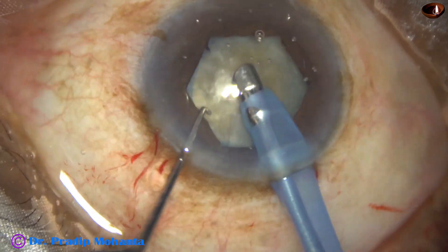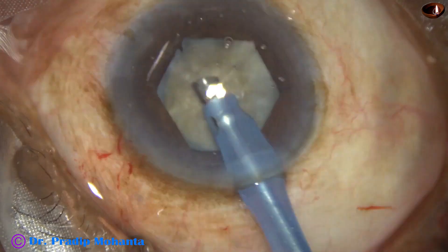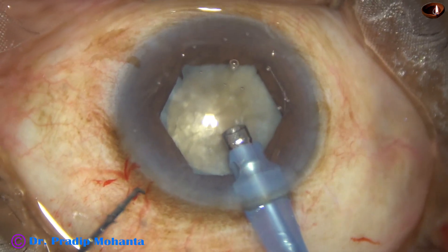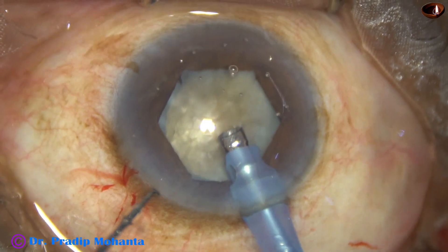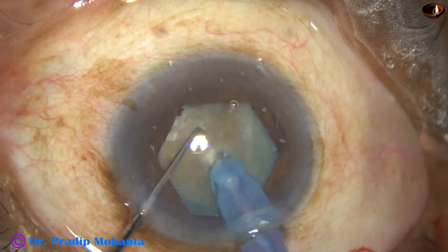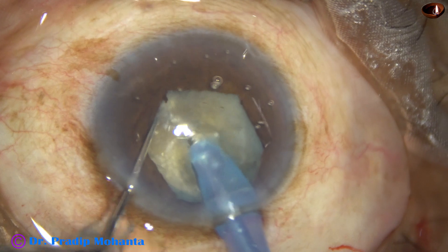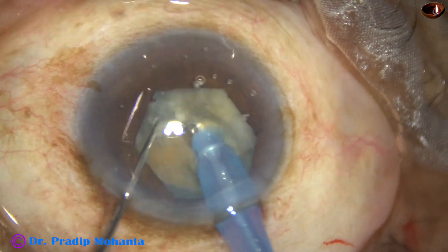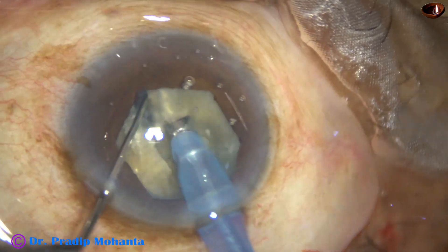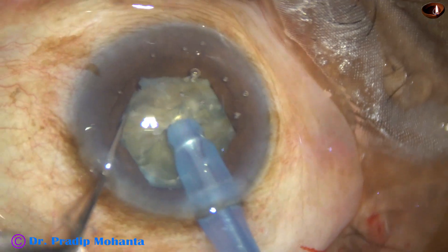First, remove some superficial lens matter. Then turn the handpiece to make the bevel up. Then use the chopper to push the nucleus a little down and bury the tip just in front of the main wound, just beyond the upper rhexis margin. Bury the tip, go through the substance of the nucleus at a deeper plane, go forward and have a nice crack. In this case, we have got a nice crack from one end to the other end.